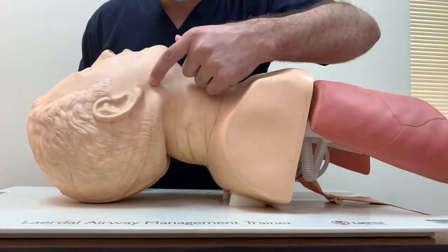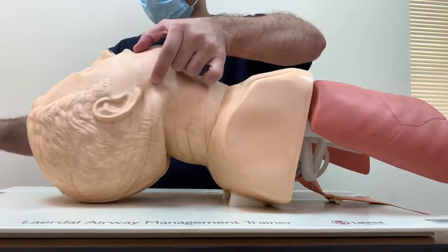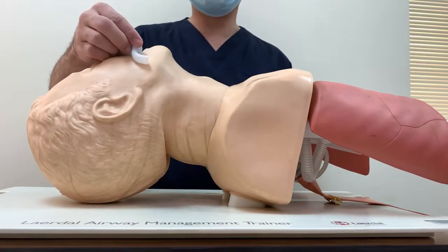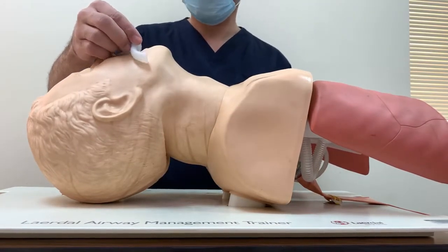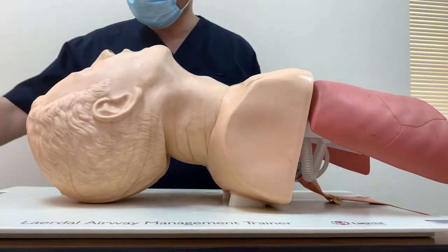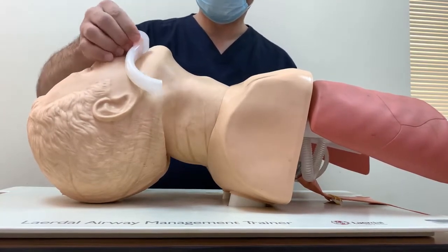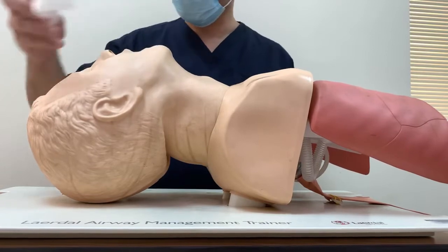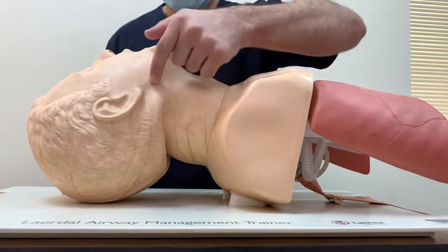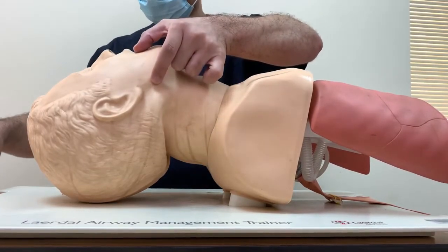An oropharyngeal airway that is too small may push the tongue into the oropharynx and cause obstruction. One that is too large might obstruct the trachea. So we need to select the proper size.